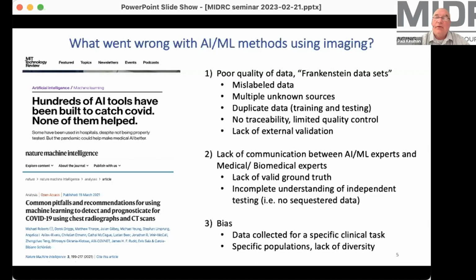There were many other, well, by many, I mean probably at least another 4 high-level reviews that all came to the same conclusion. And it was for a combination of reasons. The one that we're going to focus on here is the poor quality of data. And one of the papers coined the term Frankenstein data sets. Now, that's a specific case where somebody well-intentioned is building a cohort of data and they include somebody else's cohort without realizing that they're duplicating cohorts because the other data they had has already been incorporated. And as well, it is just the tip of the iceberg in terms of understanding the data.